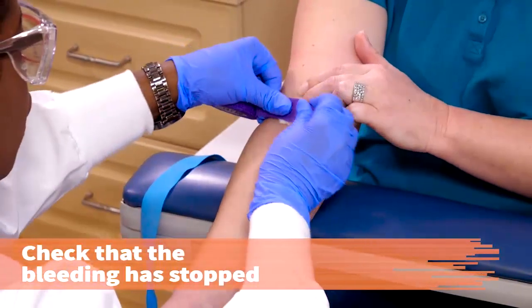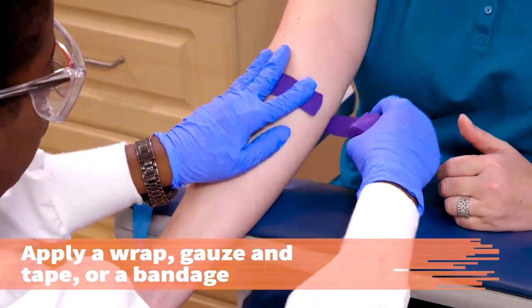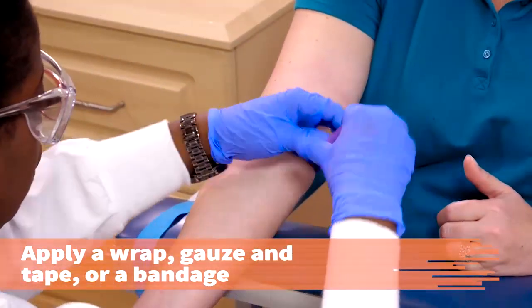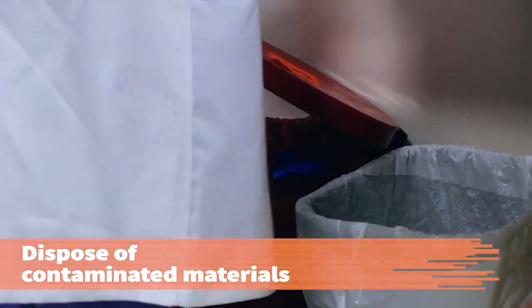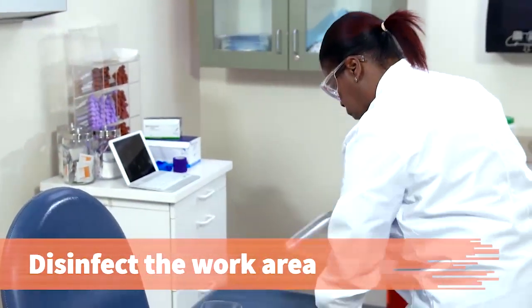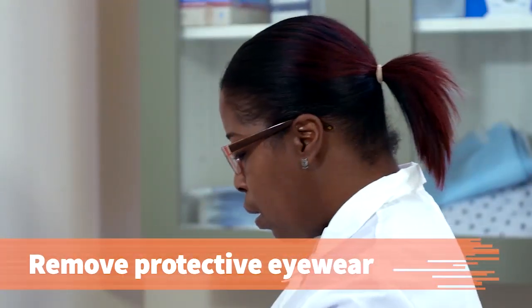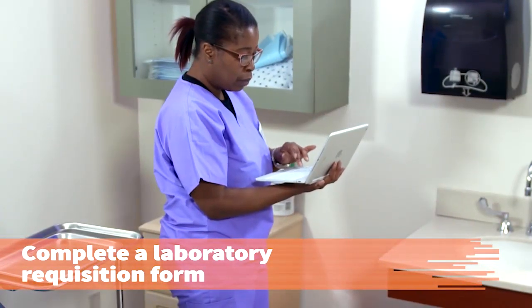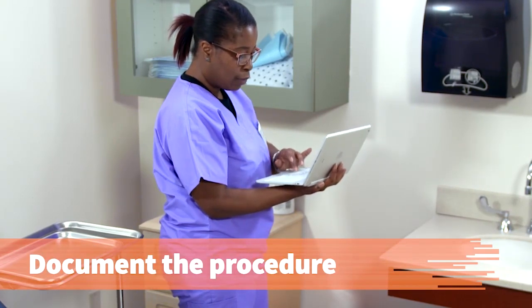Check the venipuncture site to make sure bleeding has stopped. Apply a hypoallergenic self-stick wrap, gauze and tape, or bandage. Dispose of blood-contaminated materials in the biohazard waste container. Disinfect the work area. Remove and dispose of your gloves, then remove your protective eyewear. Sanitize your hands. Complete the laboratory requisition form and route the specimen to the proper place. Document the procedure in the patient's record.